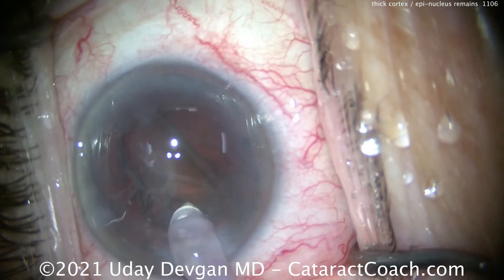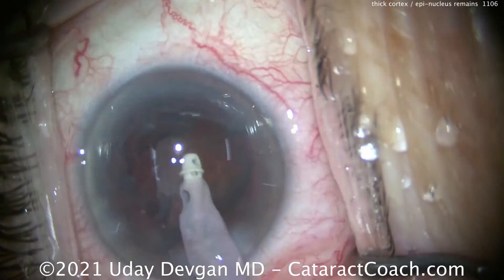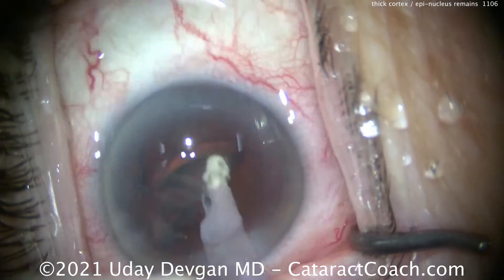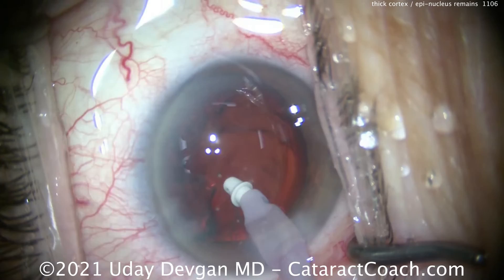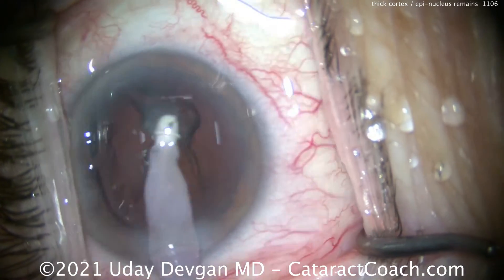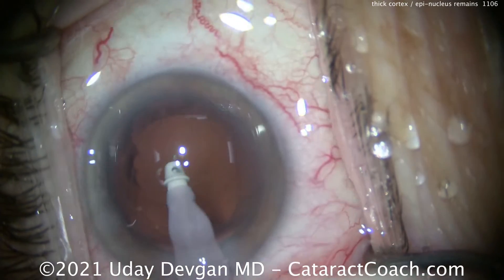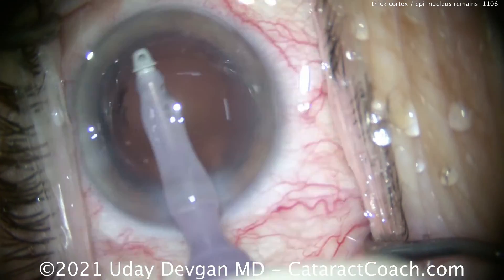So now going around, trying to remove this nice and easy. We're just doing this back and forth motion to really help free this shell from the posterior capsule, from whatever cortex is remaining. The goal is to first get that epinuclear shell out, and it may take a lot of maneuvering back and forth. You can see this is a prolonged thing — in this case, cortex removal is going to take longer than actual nucleus removal.